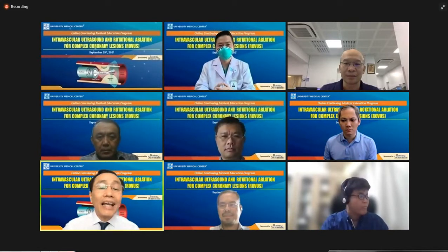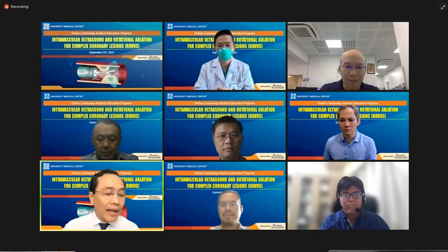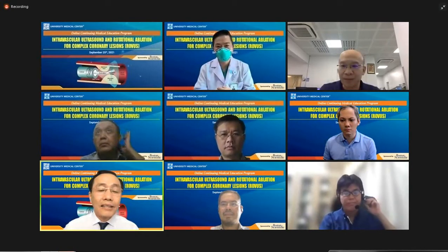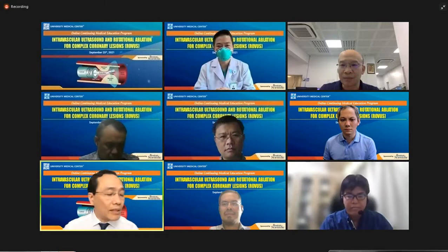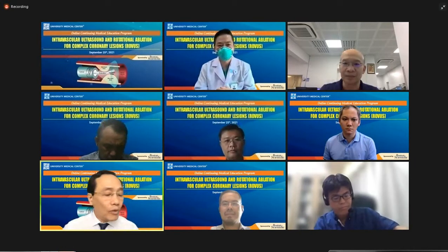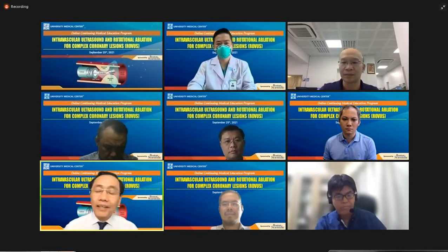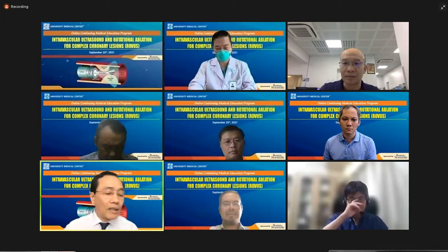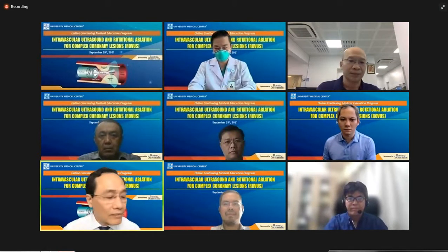Today, we have a lecture, Roles of IVUS in Bifurcation Lesion, and we have a case sharing and discussion. And we also have a live case from University Medical Center. I am sure that by these courses, we will have a chance to learn from each other and will become operators who can use IVUS in PCI for the bifurcation lesion.